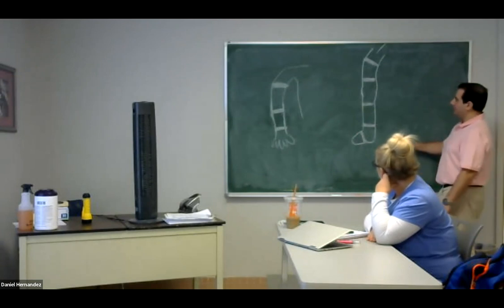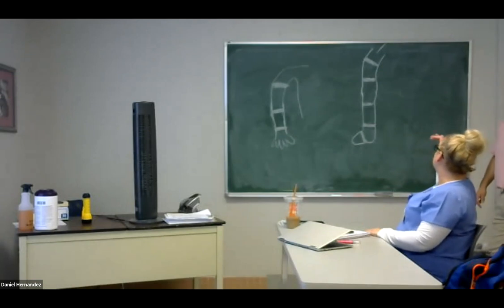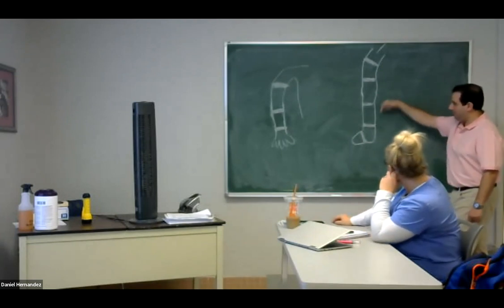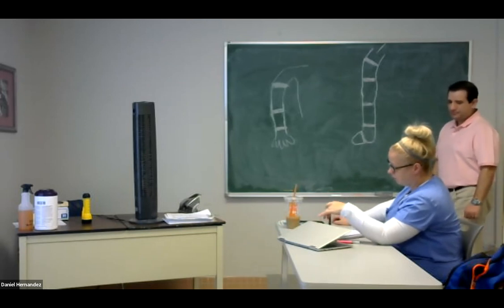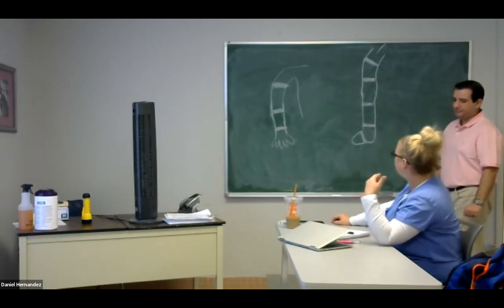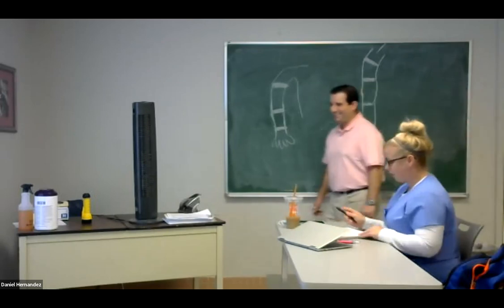What do you mean? Like it's normal, abnormal. You would never have a situation like that, because wherever the abnormal is, it's going to affect everything down below, and everything else would be abnormal. And you couldn't have a situation where the pressures were the same but it's sclerosed. Okay, never mind. I'm just going to go with no, and not try to make things complicated.